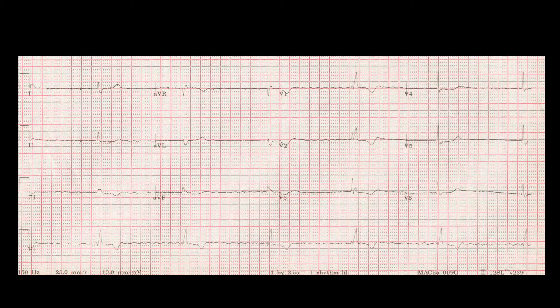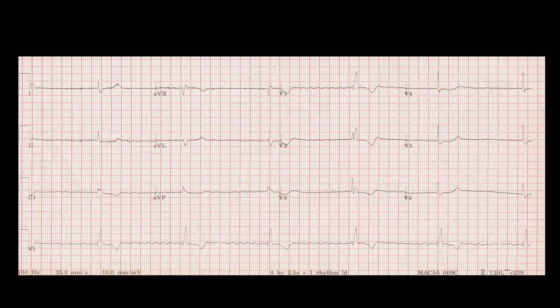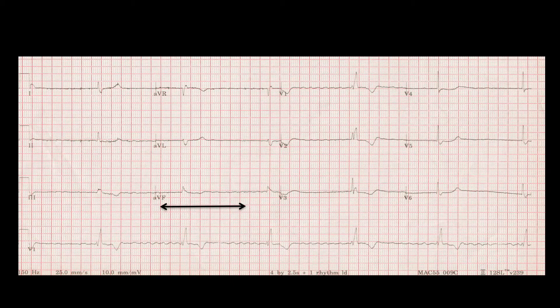Looking at this next ECG showing irregular and slow atrial fibrillation: the axis is normal as the QRS complexes in lead one and lead two are both positive. However, there are no discernible P waves and there is a fibrillatory wandering baseline. The QRS is over three small squares, so it's broad, and the rate is definitely over five big squares, representing bradycardia. So we have atrial fibrillation with a broad bradycardic QRS.